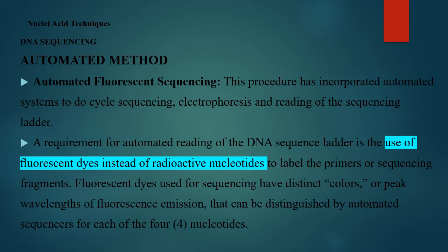So, for example, in the past, if you wanted to read the Hb, you needed your Drabkin's solution. You manually pipette. You put it into your either colorimeter or spectrophotometer, whichever is available. You take the reading, then you calculate. Now, in a fully automated hematology analyzer, you just get your sample, you aspirate, and then that is done.